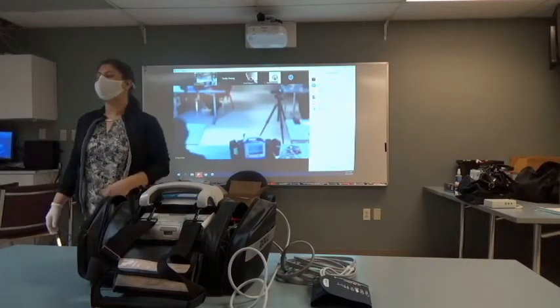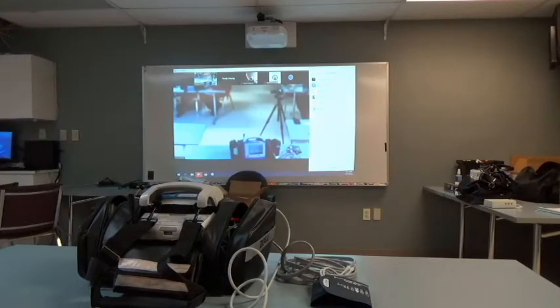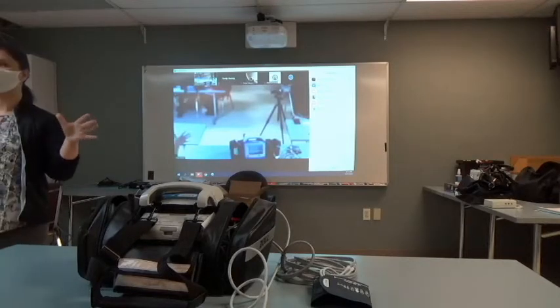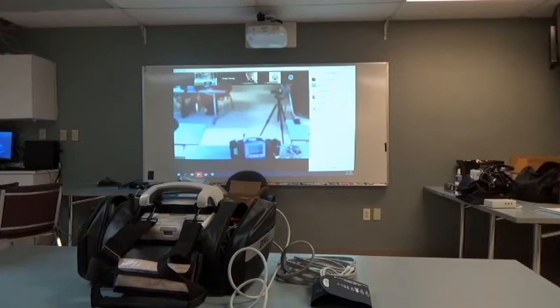Okay, so for those of you that don't have a rhythm generator, if you want to look around, you're welcome to. I only have three, so that was as much as I could fit in my suitcase. All right, so we need to make sure that we connect to that 4-lead as well. Now, if you can stay with me on this part, this is going to be important because I want to make sure you get all the features that you can get on this 12-lead.